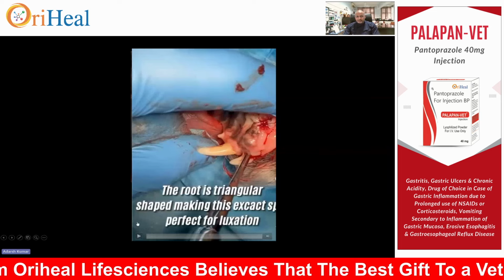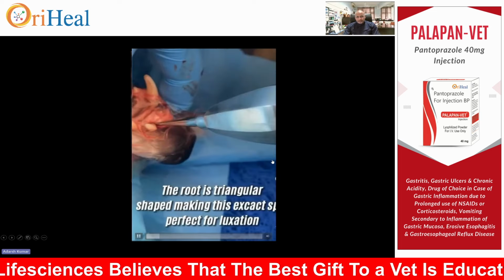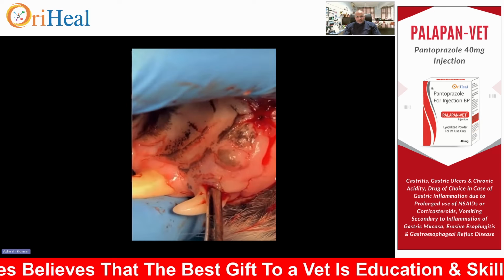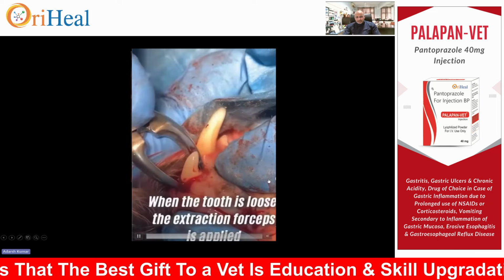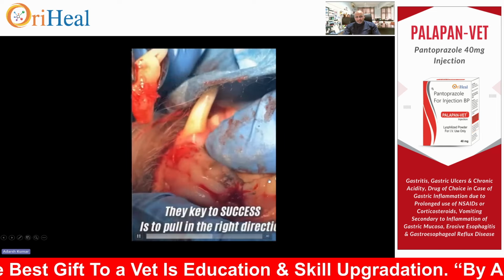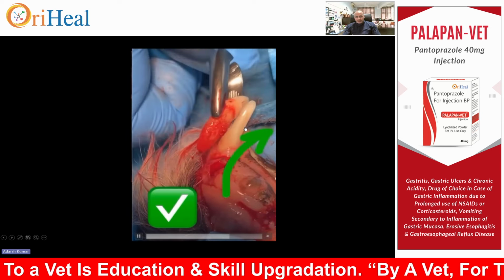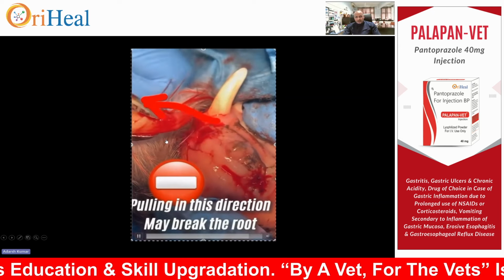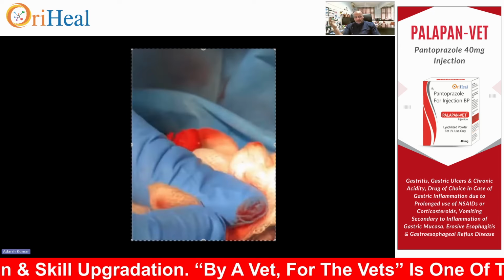Okay. Now look at this. Can you see this is without the flap, right? It is inserted inside and you wait for some time and then you take it out. This is the canine which has been taken out, in the direction. This is correct. But don't go the other way. It will cut open the nasal passages. Okay. This is specific for the canines.